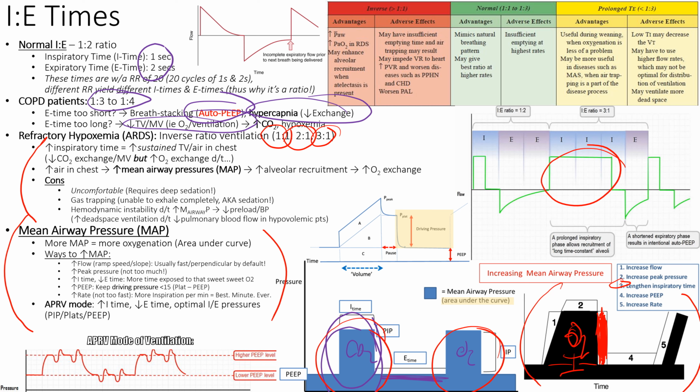And yes, there's PEEP, because we can raise PEEP, right? That's number 4 here. Let's raise the PEEP. That's more area under the curve. That's more exposure to oxygen at all times, right? And then what happens when you start doing this? Again, it's not comfortable.